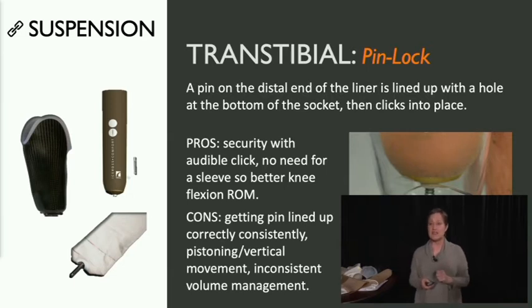So between the two systems I've talked about already, you can see how you as a therapist, even before your patient gets a prosthesis, you can contribute to that conversation of what suspension system might be the best for them. Because you know what their manual dexterity is, you know what their cognitive processing is, you know what their mobility is, their balance, their sitting balance, all of those things. So you might be able to contribute to that discussion and say, wow, I really don't know that a pin lock is going to work for my patient because... or vice versa. Maybe the suction won't work for them for reasons that you've noticed.